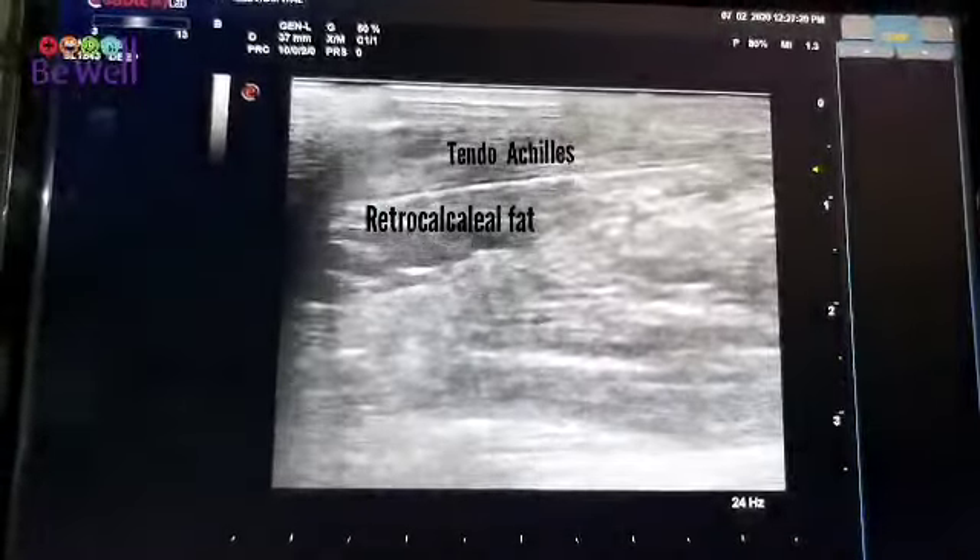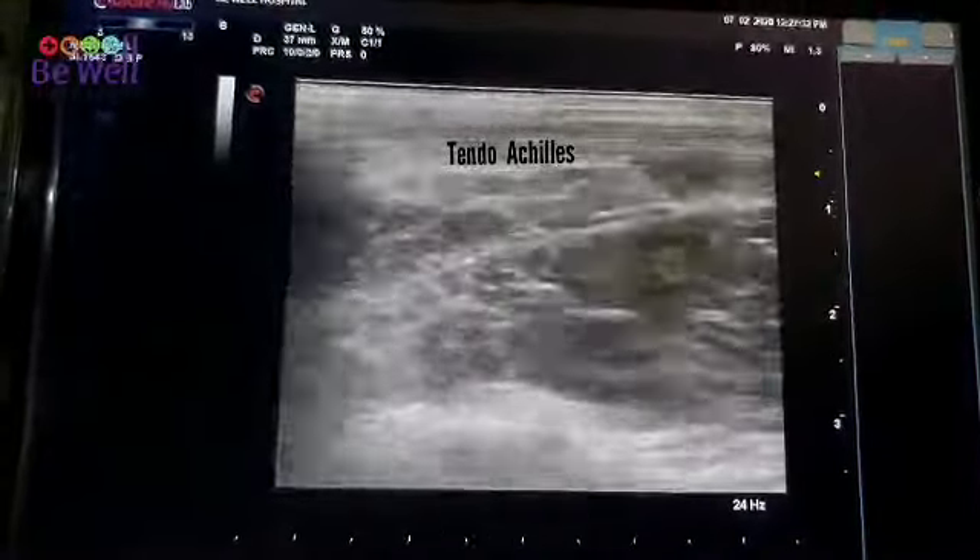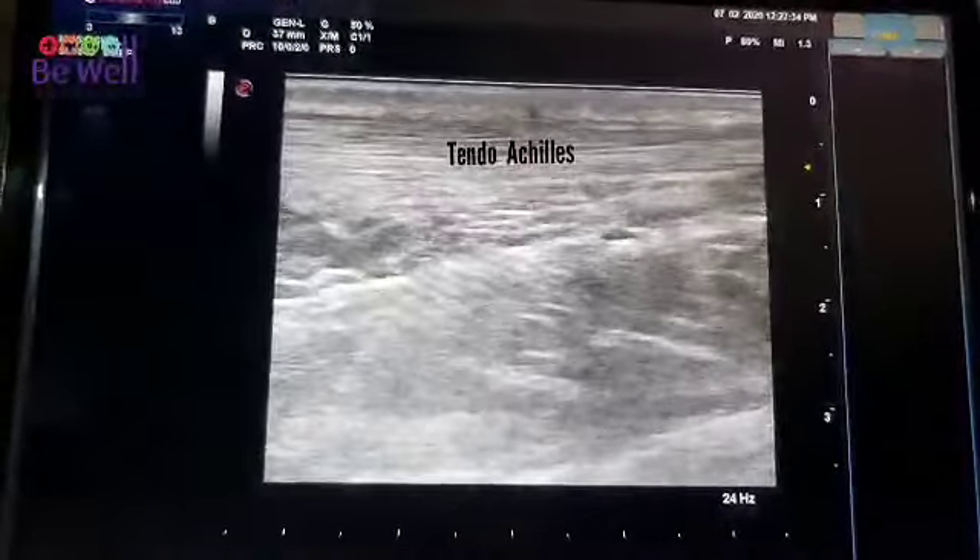I am going up the tendo Achilles, doing a scan all around it. It seems quite good.